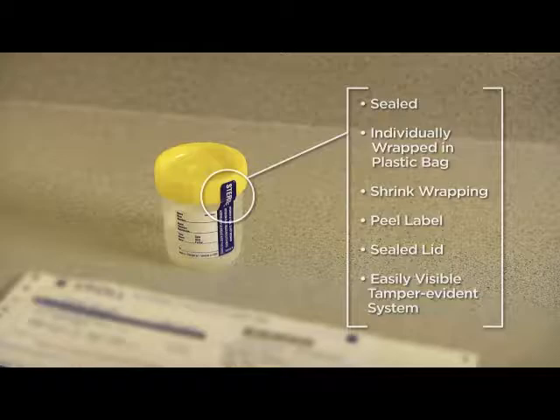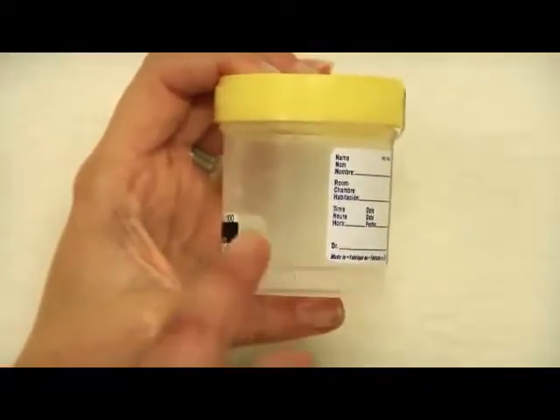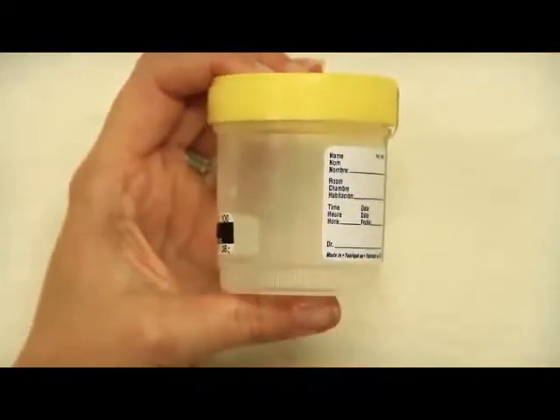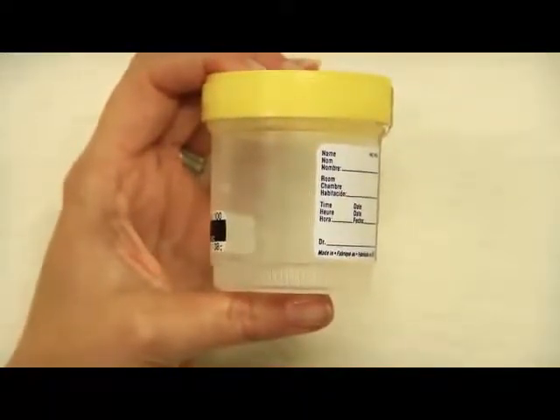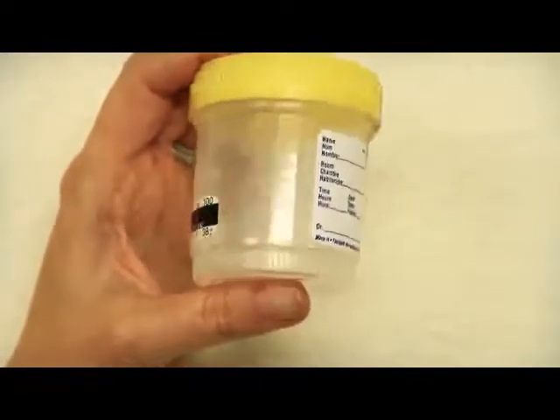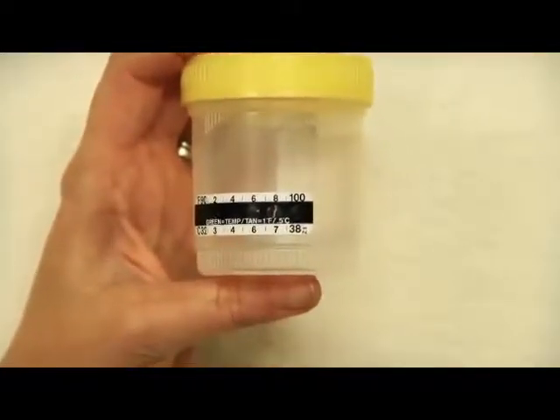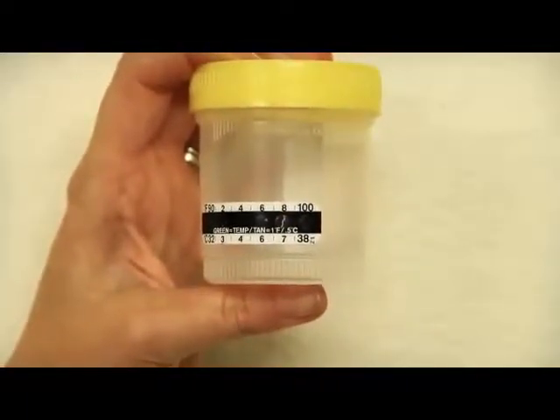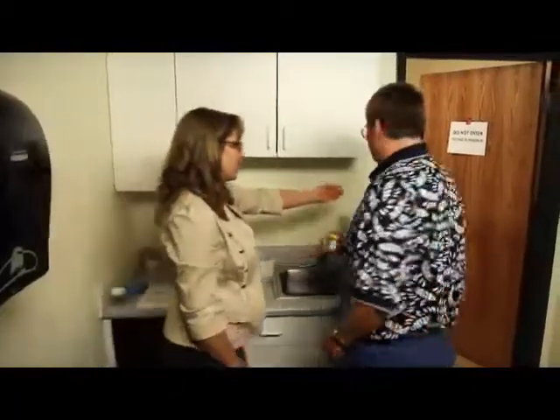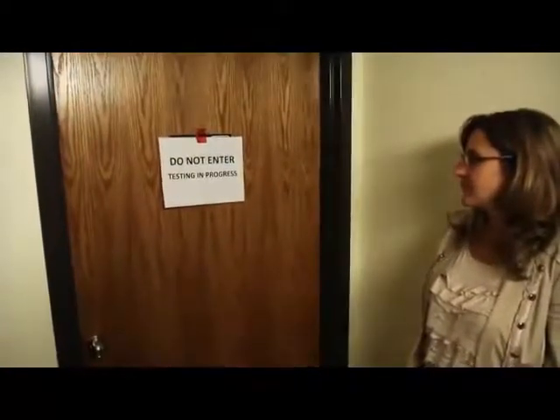Direct the donor to go into the room used for urination and provide a specimen of at least 45 milliliters. Inform them not to flush the toilet and to return with the specimen as soon as possible after completing their void. Advise the donor that the temperature of the specimen is a critical factor and that the donor must bring the specimen to you as soon as possible after urination. It is the collector's responsibility to pay close attention to the donor during the entire collection process to note any conduct that clearly indicates an attempt to substitute or adulterate a specimen.